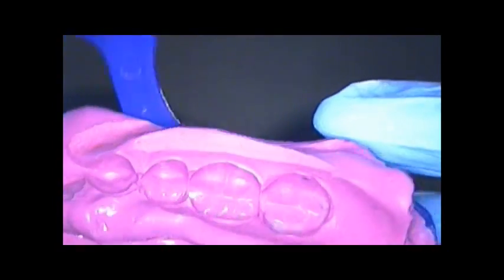And while I'm letting it set, I'll try to discuss some more of what I do with getting ready to make the temporary. I am filming through a microscope, so it's an automated color for the microscope. I now have the alginate impression in my hand. I'm going to go ahead and show you what I do.